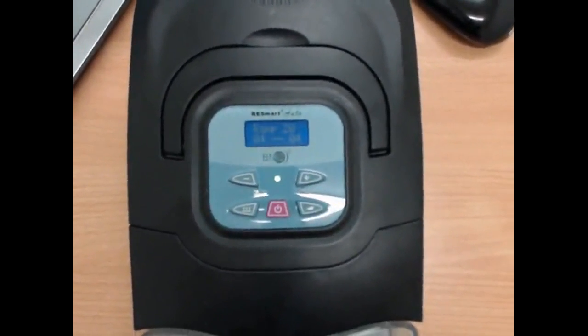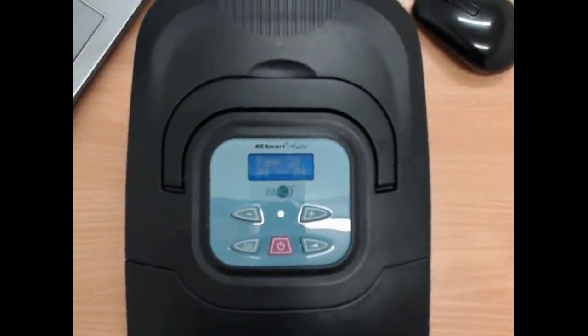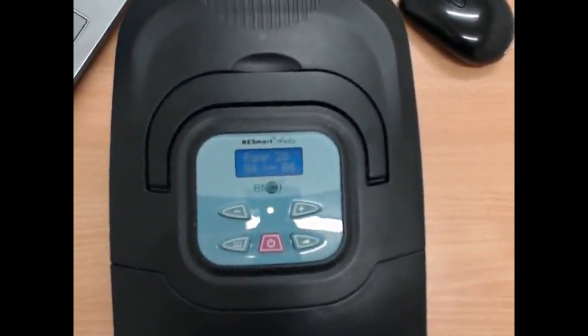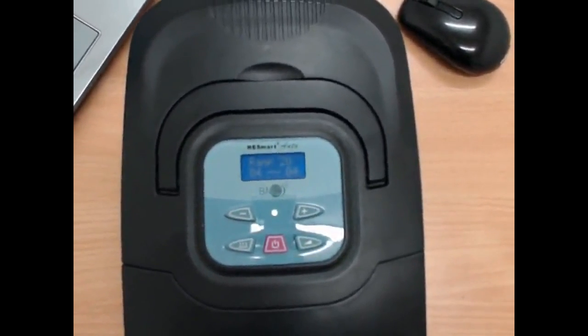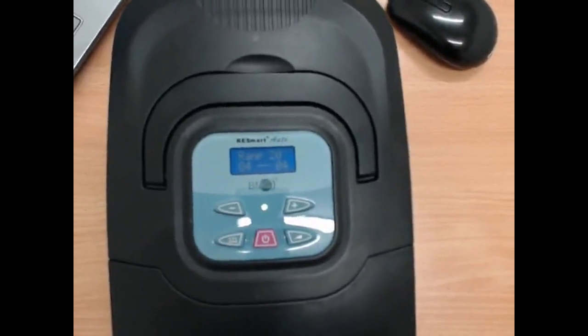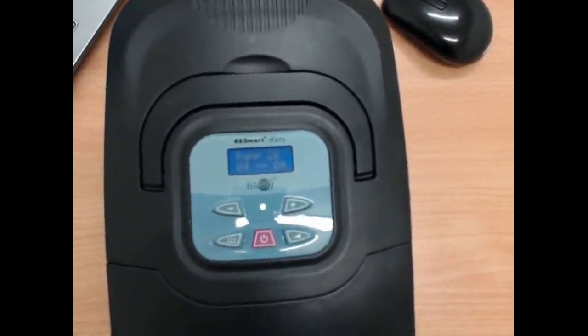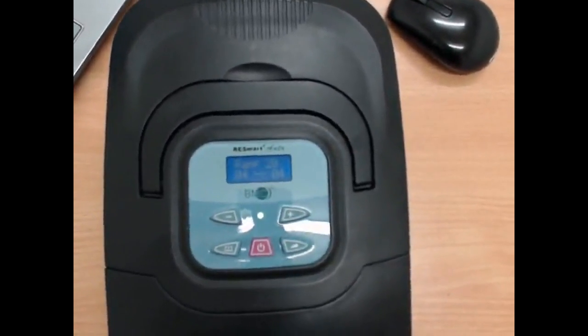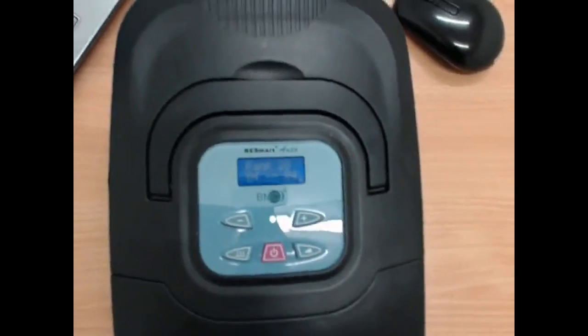So to start with, I'm just going to show you how to access basic patient settings. We'll go to clinical settings later, but basic patient settings are ones that you can change quite easily. They're things like changing the amount of humidification, turning things on, such as automatic on or automatic off, and a few other bits and pieces as well.